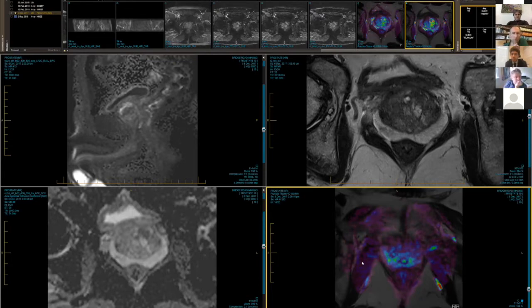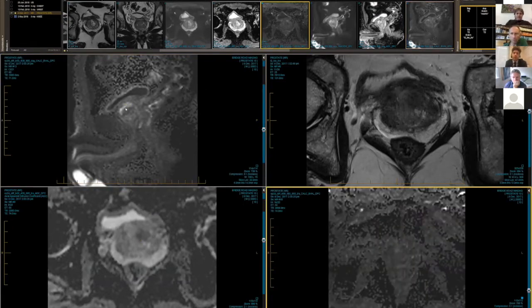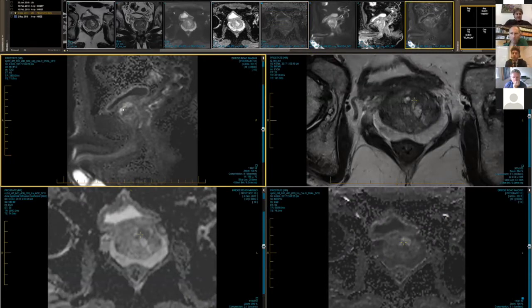Roberto, what do you think? What's your general practice in Rome? Are you always using multi-parametric, which is still the standard? Roberto? He's muted. Oh, you're on mute. Sorry. Yeah, I was muted. In Rome, we use multi-parametric MRI for most of the patients, very few biparametric.